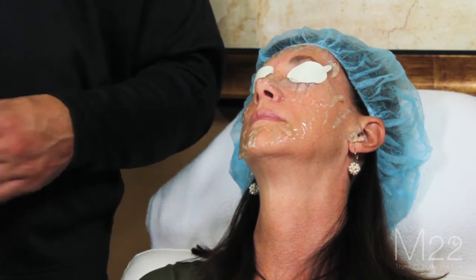We remove the gel. Once we're done, we bring the patient over to the slit lamp and perform a meibomian gland expression. What we found is that when patients receive IPL to the skin around the lid margin, heat is generated in the dermis, which dilates the meibomian glands and melts the secretions. There's a heat wave that goes from lower to upper lid, so we get that same heating effect on the upper meibomian glands, allowing us to express those as well.